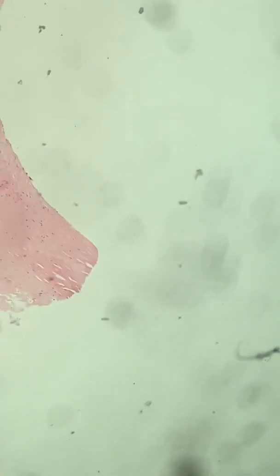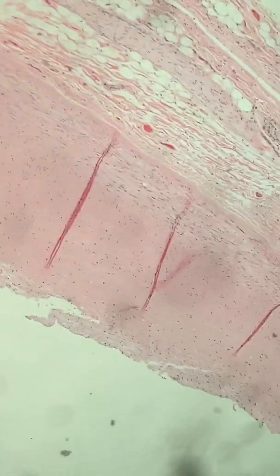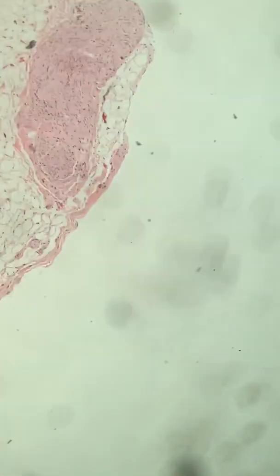So next, I usually take a section of the coronary artery. Here is one coronary artery. You can see the lumen there, and you can see the wall there. Not much other than a little atheromatous change in this middle-aged male, but not bad at all. Very widely patent.